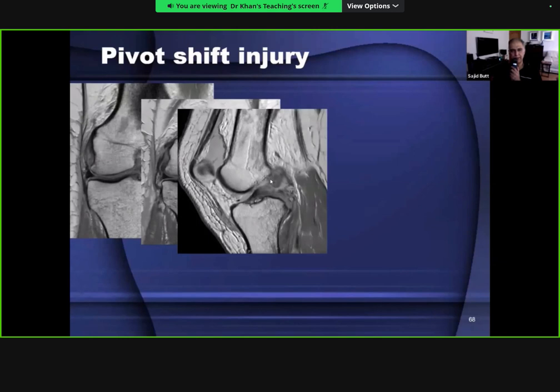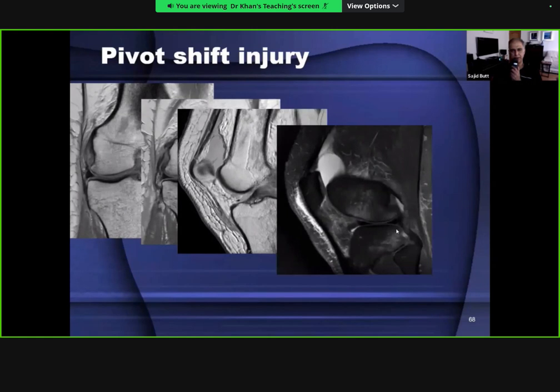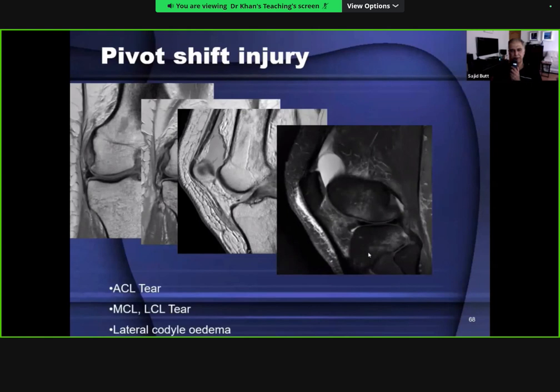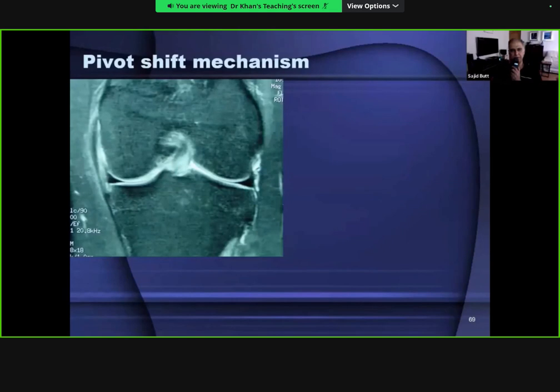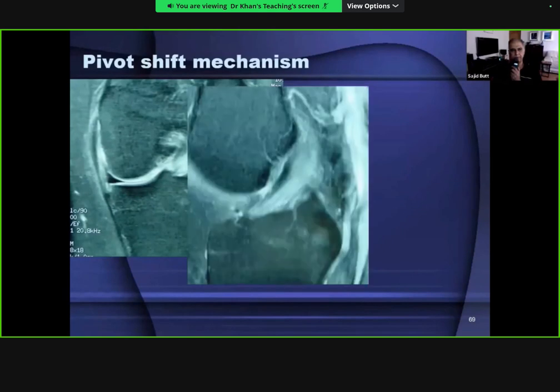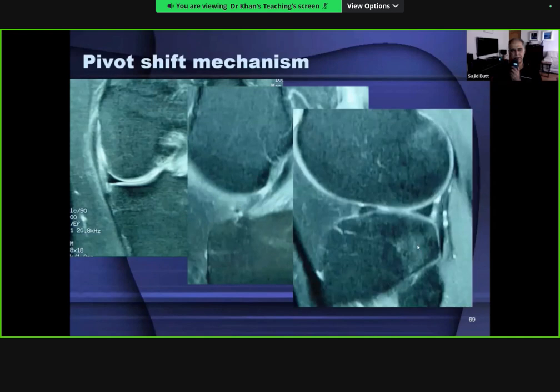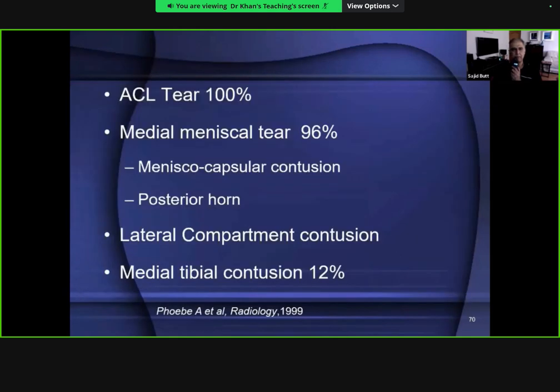With a tear of the ACL, characteristic bone bruising is present on the lateral femoral and tibial condyles, with some edema of the medial femoral condyle. In a full thickness ACL rupture, note bright signal intensity and bone bruising on the lateral side of the tibiofemoral articulation. ACL tears also cause medial meniscal tears, menisco-capsular contusions and posterior horn tears, lateral compartment contusions, and medial tibial contusions.